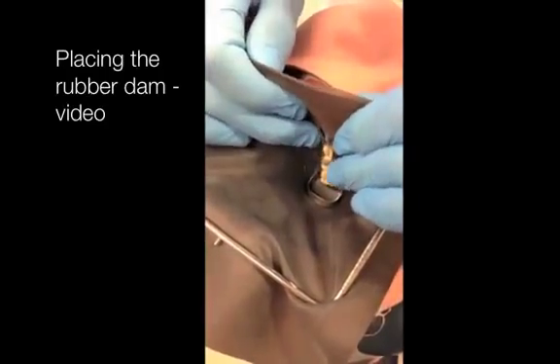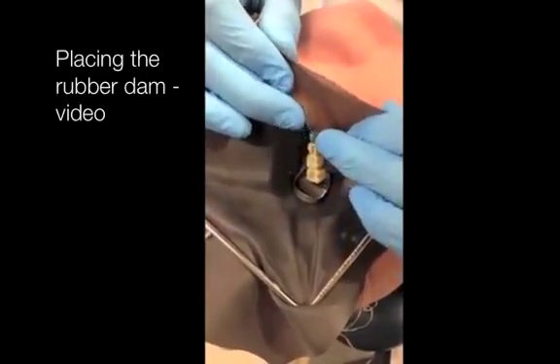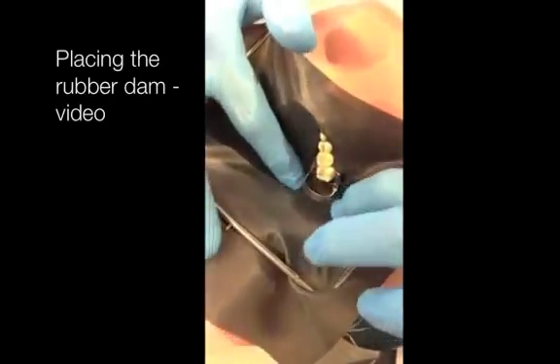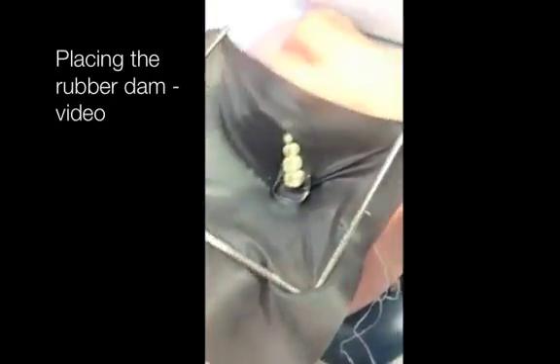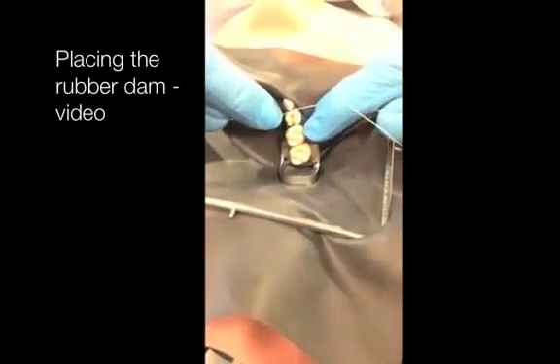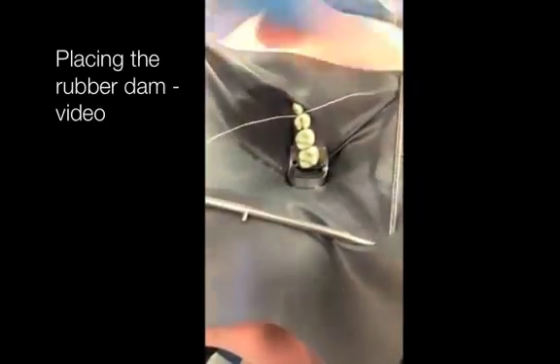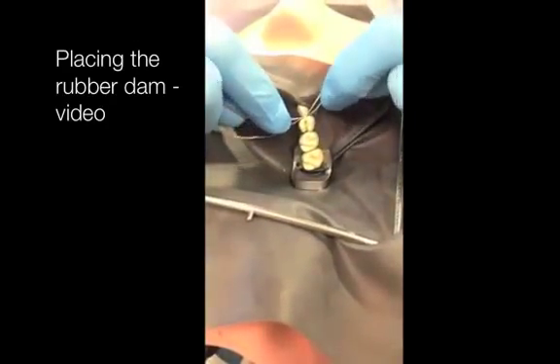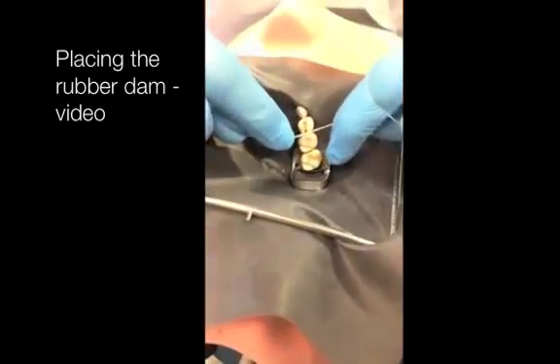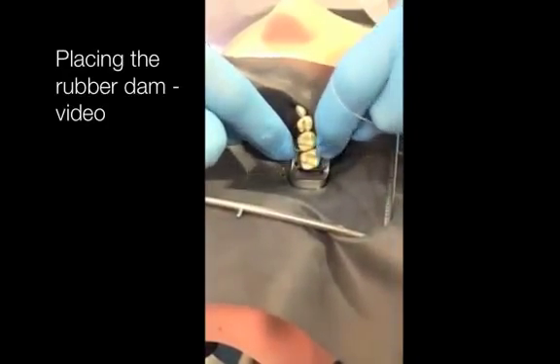Now it's time to pull the rubber dam forward for the individual teeth, really not taking your hands off the dam at any time because you're keeping that gingival pressure. Our dam's on. Continue to relax the dam behind the rubber dam clamp to prevent it from popping off. Then your great technique: floss down, then floss again with the same piece of floss without pulling it out. This keeps the dam nice and secure, then pull out the floss. Nice inversion and we're almost ready to go.